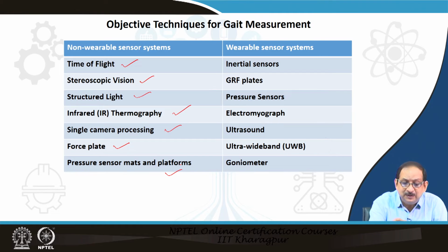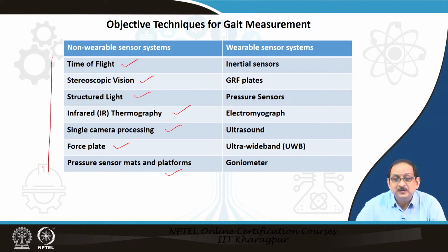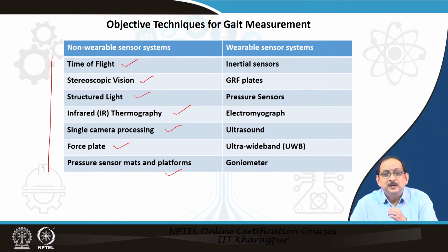So, in this category of non-wearable sensors, there is no need to wear a sensor on any body part in order to do gait analysis.